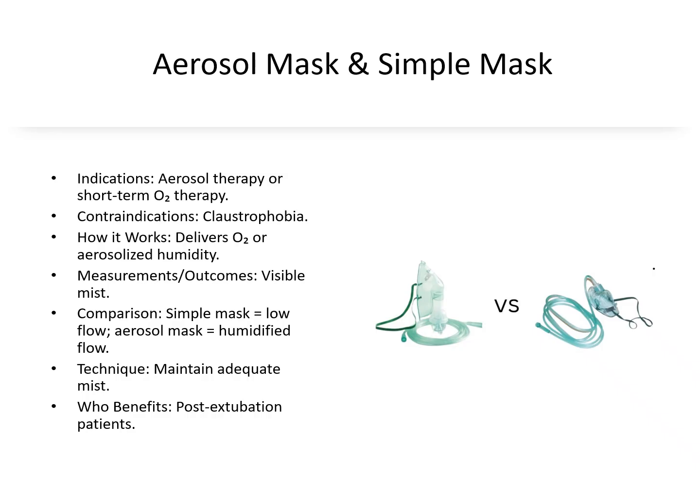Simple and aerosol masks are used for humidity and aerosol medication. Patients who are claustrophobic may not tolerate these devices. They work by delivering oxygen or visible aerosol mist. Outcomes include improved humidity and medication delivery.